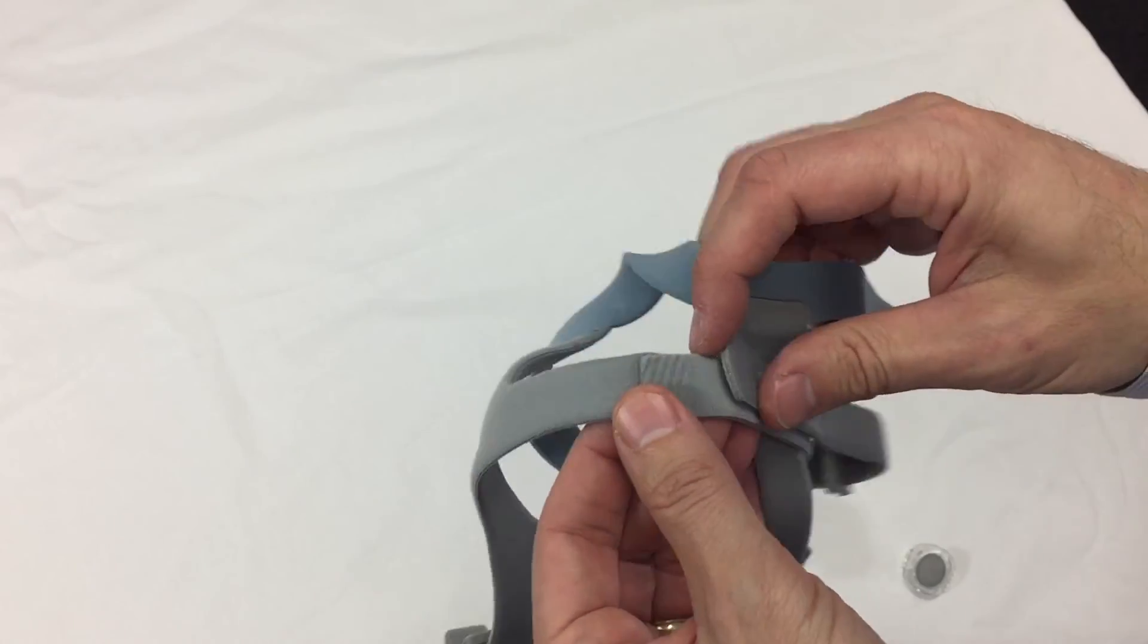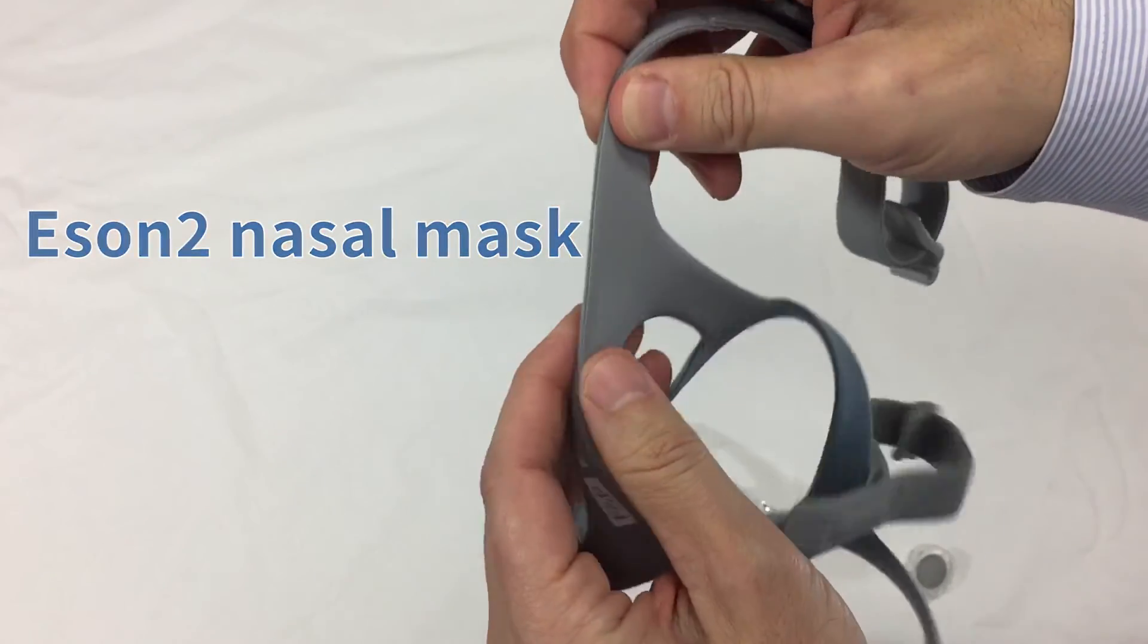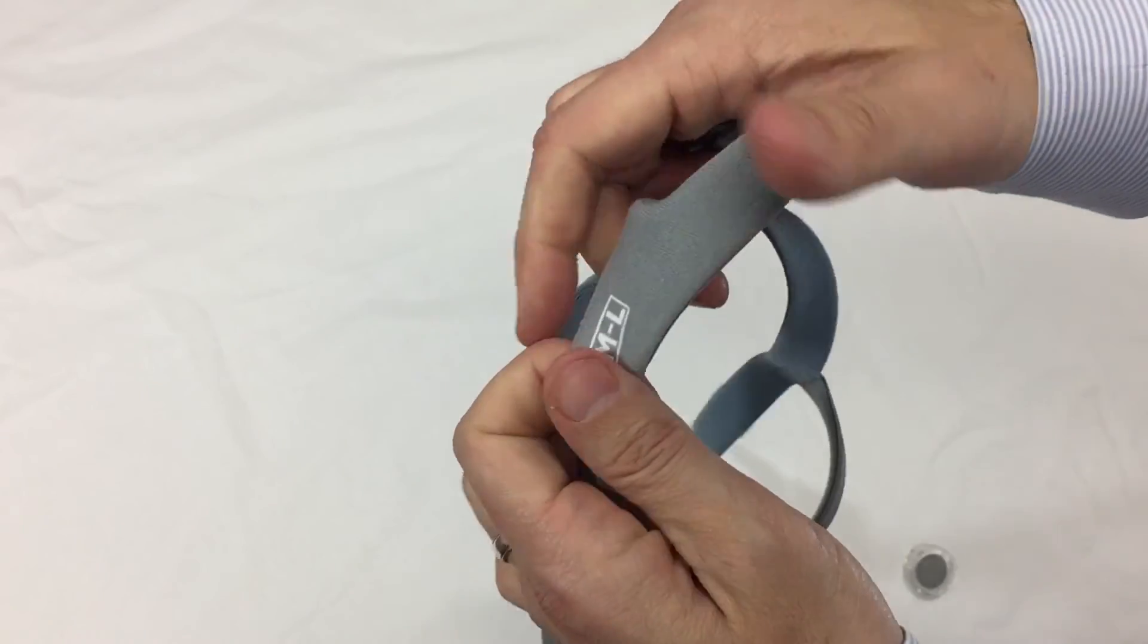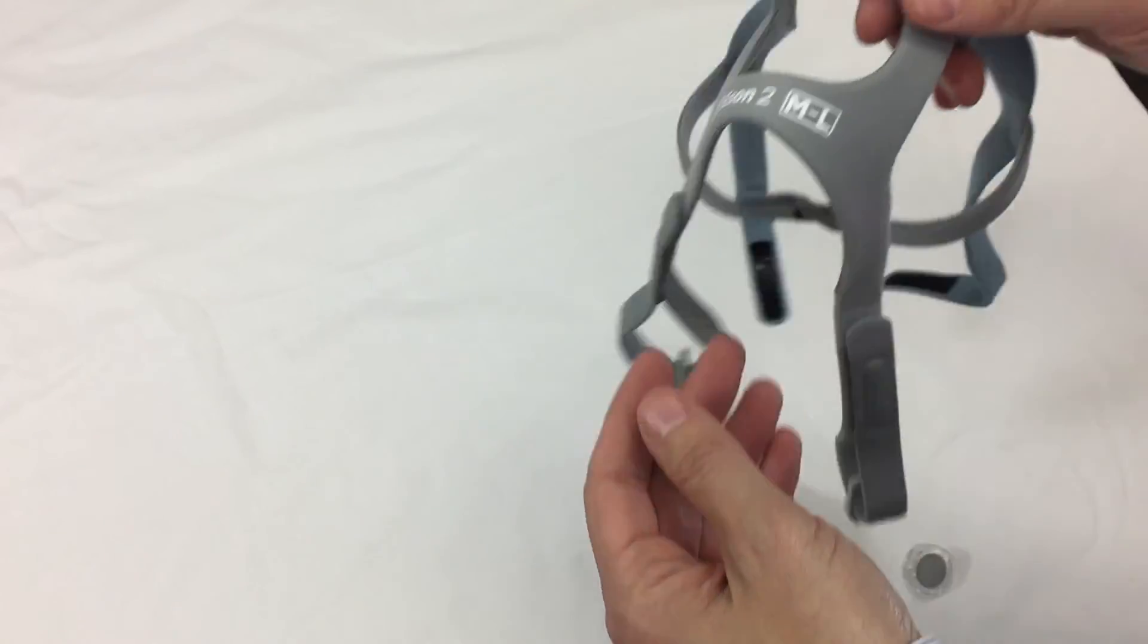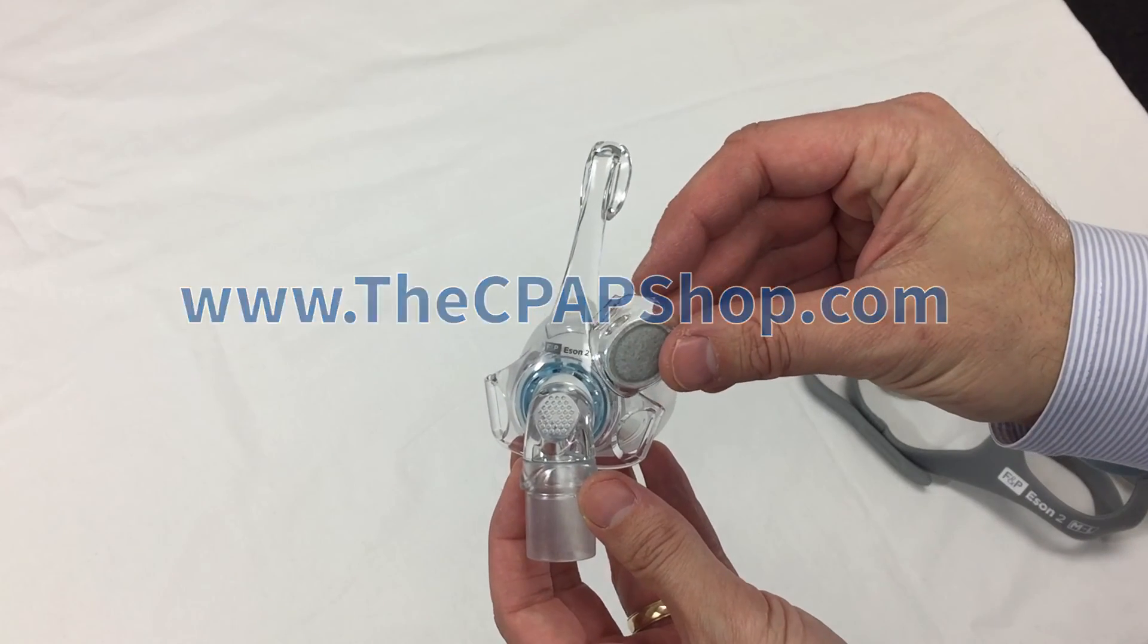And the new Fisher Paykel Isan 2 mask is available on our website. As well as CPAP machines and supplies. And that website is www.thecpapshop.com.